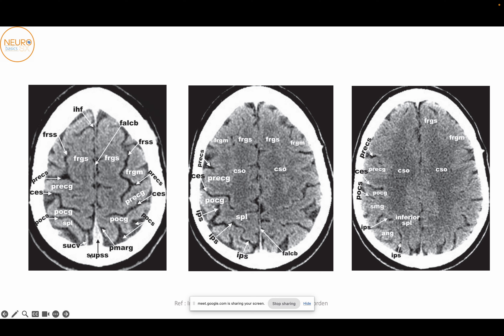Starting from the superior end, this is the interhemispheric fissure. We've got the superior frontal gyrus, the middle frontal gyrus, and then the precentral gyrus, the central sulcus, and the postcentral gyrus. As we go inferiorly, we start seeing more and more of the white matter — here we've got the frontal parietal white matter also known as the centrum semiovale. You can see the precentral gyrus and the much thinner postcentral gyrus, and behind that the superior parietal lobule, interparietal sulcus, and inferior parietal lobule.